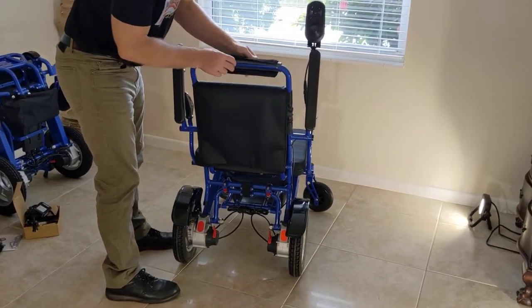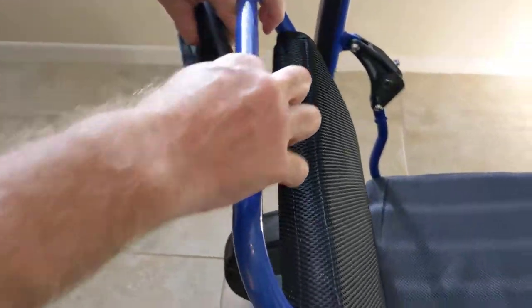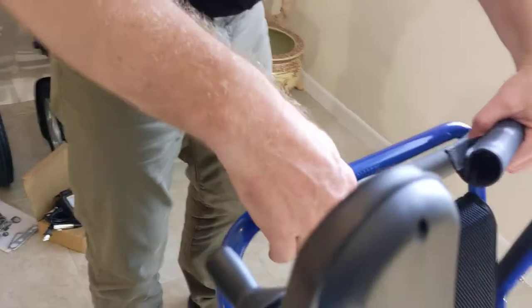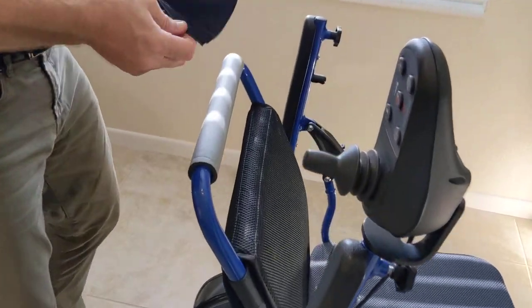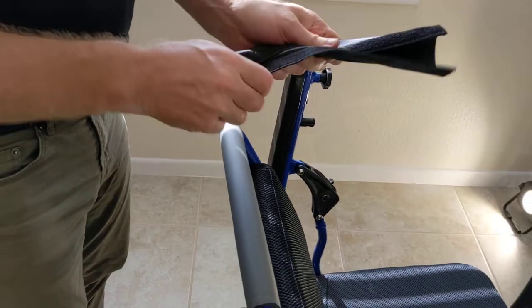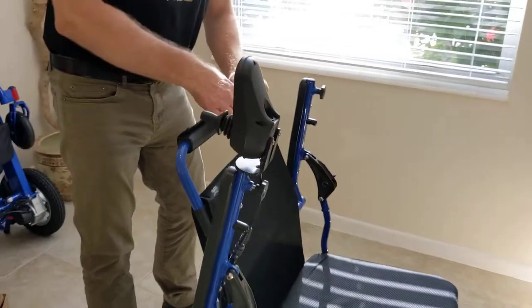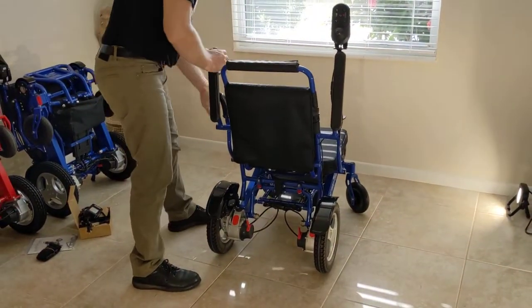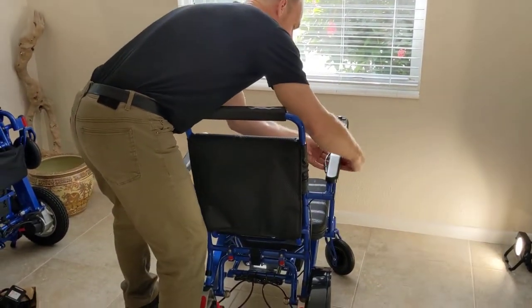Each chair has its own serial number located on the top of the chair just underneath the handle. The handle space is also where you would attach the attendant controller bracket and it provides additional padding. Accessories such as a leg extension kit and a headrest can also be used with this chair.